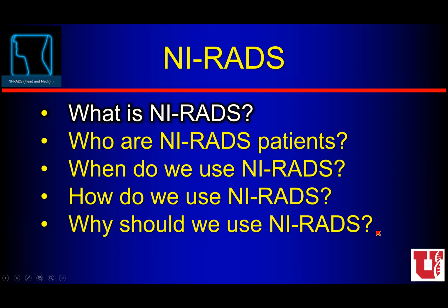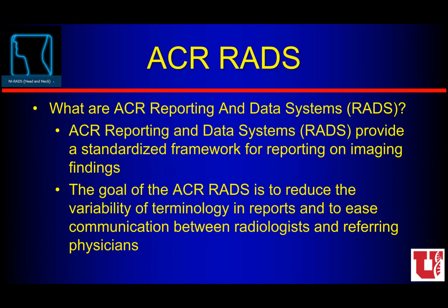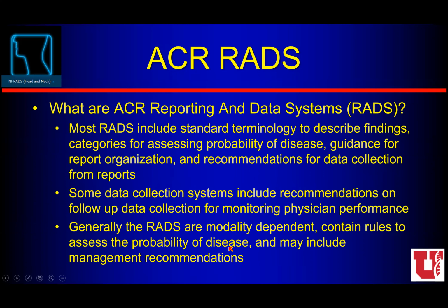I'm going to start off with what is NI-RADS. You've already heard about some of the ACR RADS, the reporting and data systems, but these are all systems to provide a standardized framework for reporting on imaging studies. The goal is to reduce variability in terminology in our reports and to ease communication. That totally makes sense. Terminology is a big deal for us. A lot of people use different words for different things, and speech recognition systems and templates are something people love to argue about in our world.